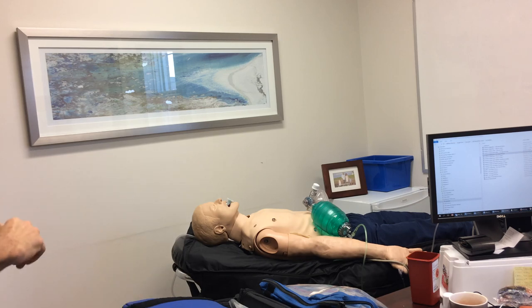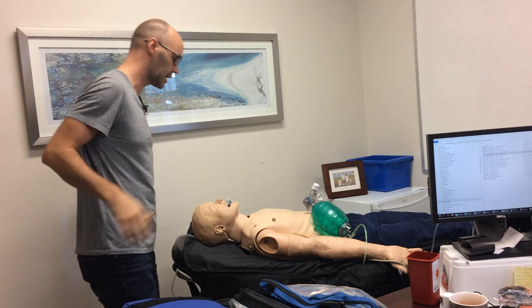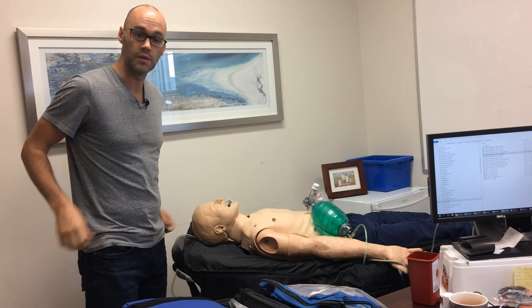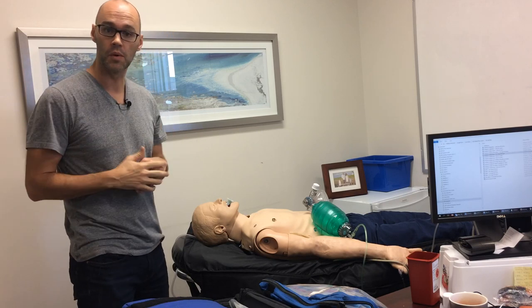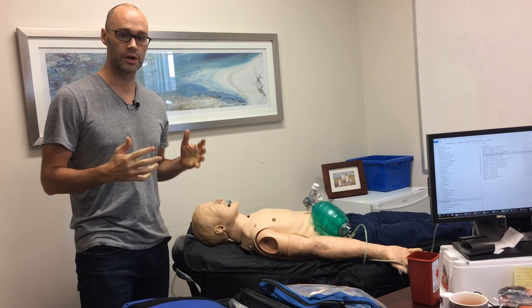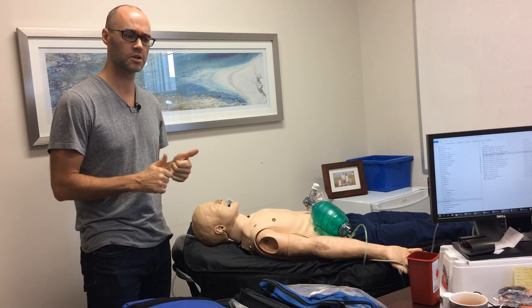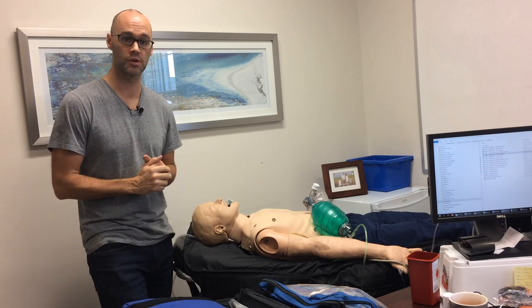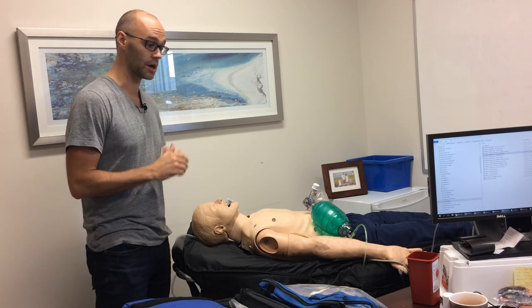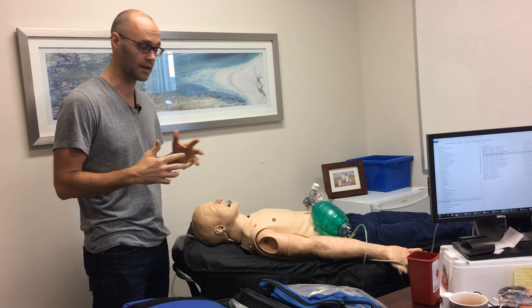So just a quick demonstration of RSI and the process that we want you to go through when you're going to intubate someone. The first question you want to ask yourself when you're going to intubate a patient is, are they currently oxygenating and ventilating?